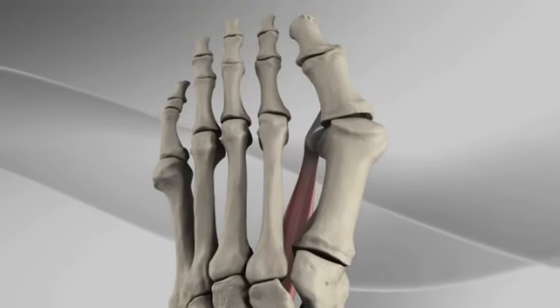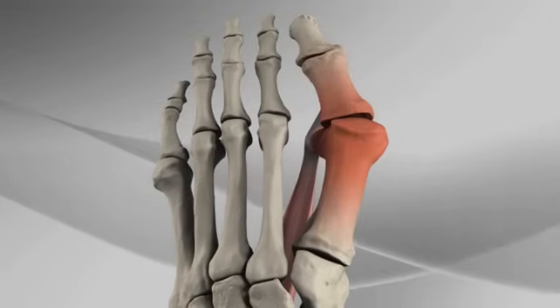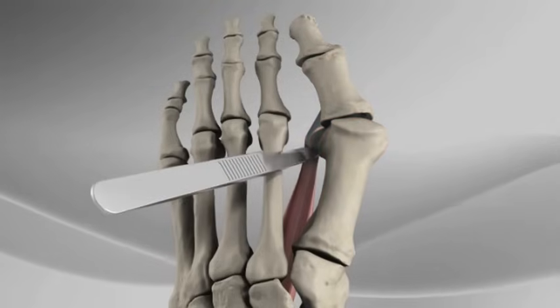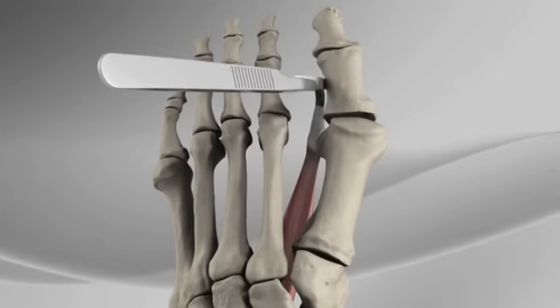The metatarsal opening wedge is a technique designed to correct bunion deformities of the foot. The surgeon begins by performing a release of the soft tissues that contribute to the deformity.